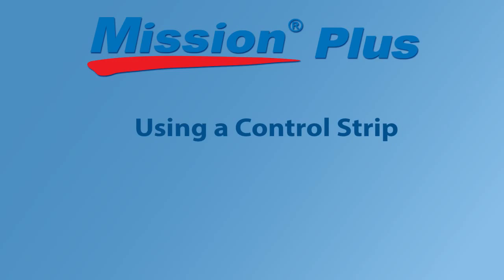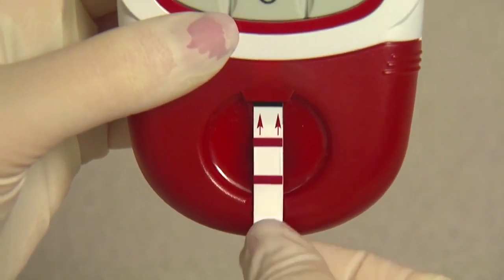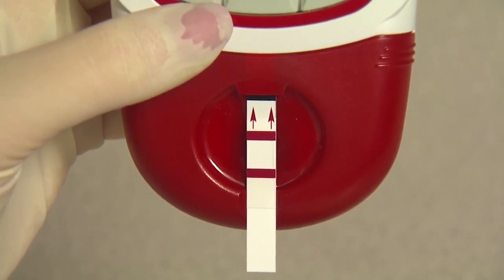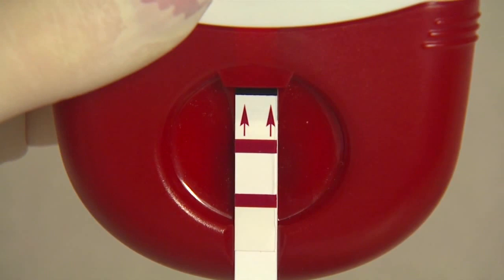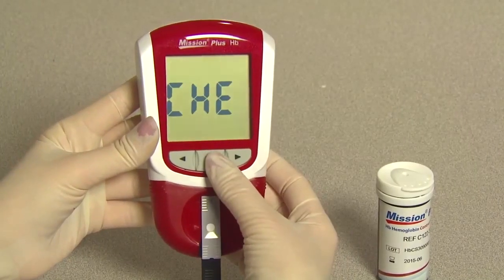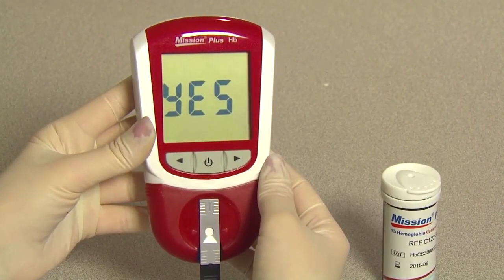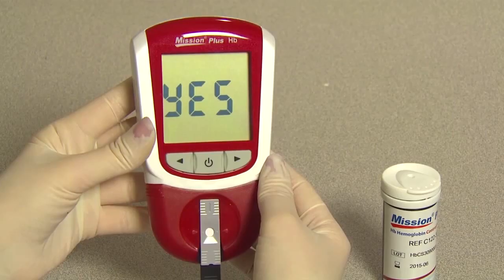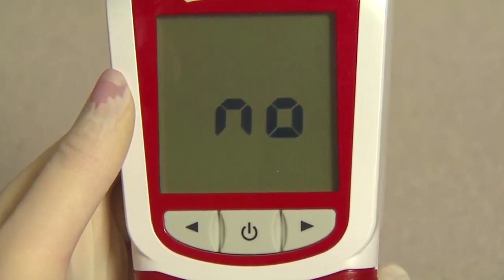Using a control strip, firmly insert the control strip into the strip channel in the same direction as the arrows indicate. Ensure that the control strip is inserted all the way to the end of the strip channel. Press the power button to start the optical check. If the meter displays yes, the meter is normal. If the meter displays no, the meter is not functioning properly.